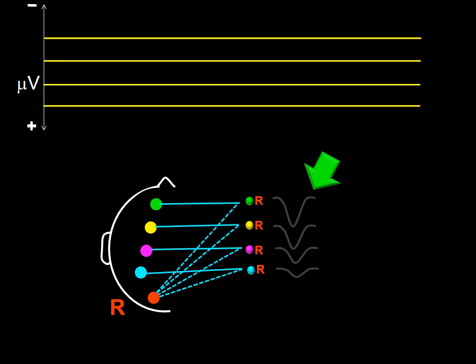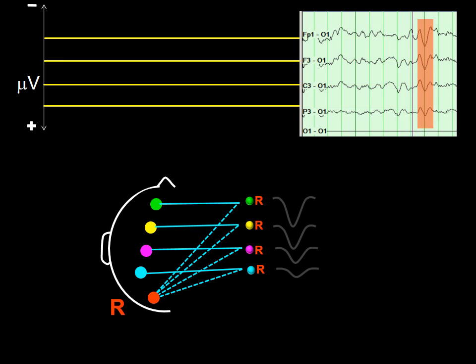I have now added a cartoonish representation of the wave in question. Notice that the amplitude transition between them is smooth. These waves represent the electroencephalographic element highlighted in the tracing in the question.